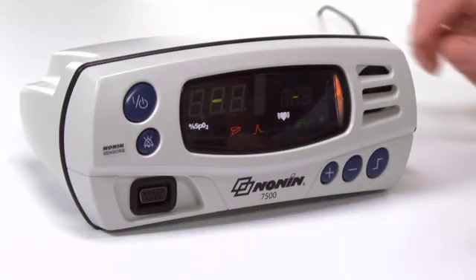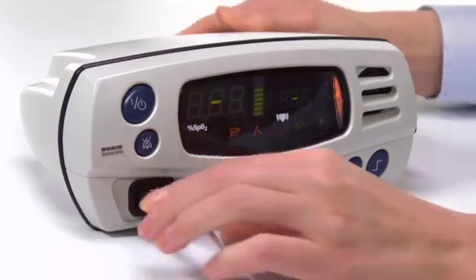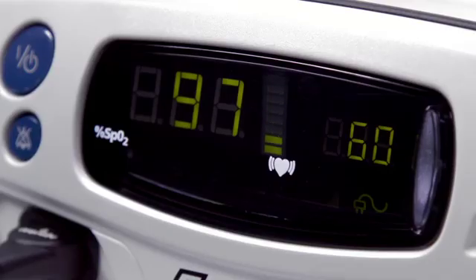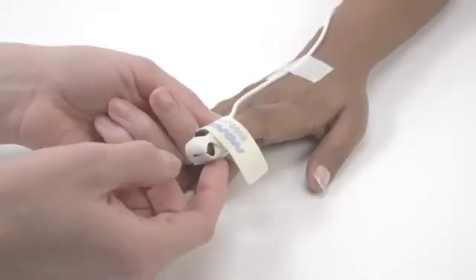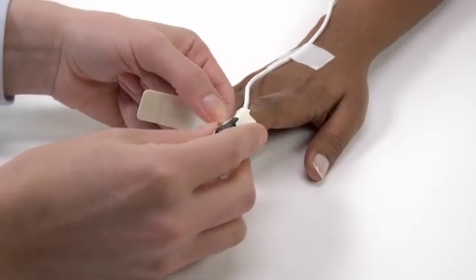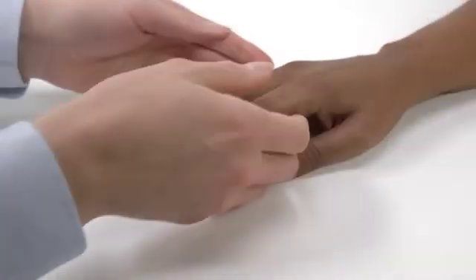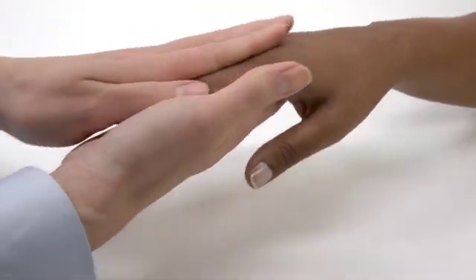You're ready to plug the sensor into the Nonin pulse oximeter to measure oxygen saturation and pulse rate. Nonin pulse oximeters have a pulse signal quality display that measures the sensor signal. If the signal is low, the emitter and detector may not be in proper alignment. Reposition the sensor to see if a stronger signal can be obtained. If repositioning does not increase the signal quality, try a different site or check that the patient's hand is warm, relaxed, and well perfused.